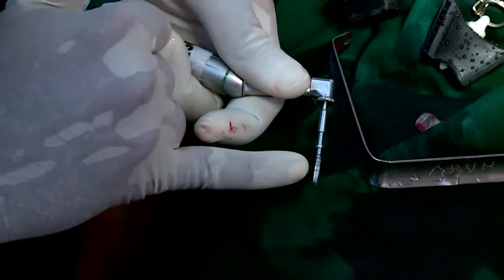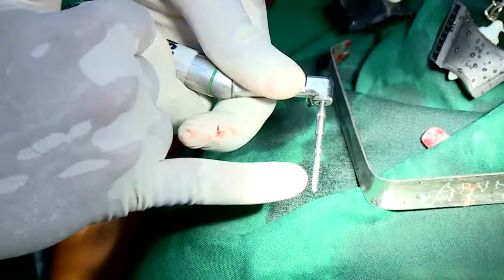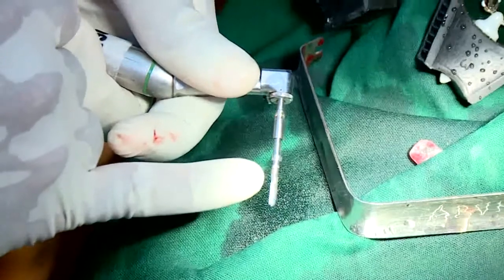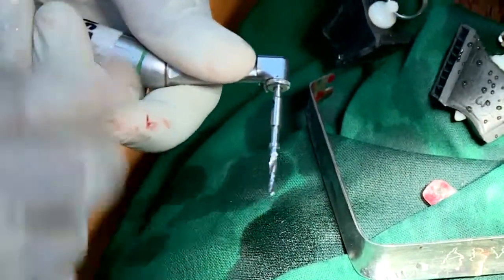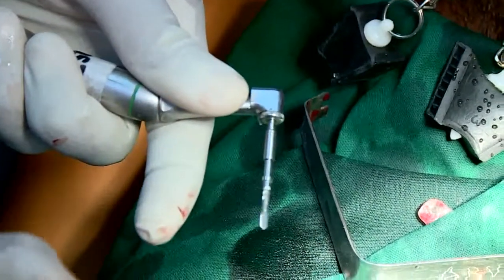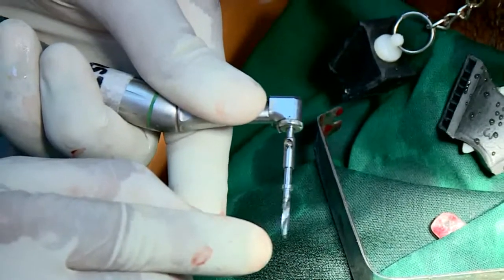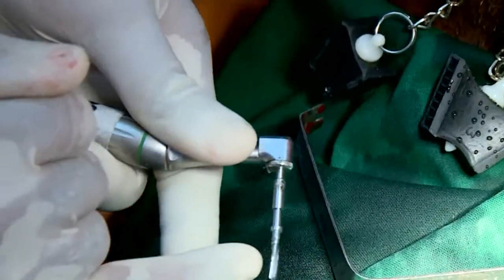Can you see the markings when it is running very clearly? The first marking will be 8, the second 10, the third usually 11.5, then 13 and 16, something like that. The end of the drill will have an apex of 1 to 1.5 millimeters, which will not engage the implant. The implant will be on the cylindrical side. Can you guys see the markings when it is running?